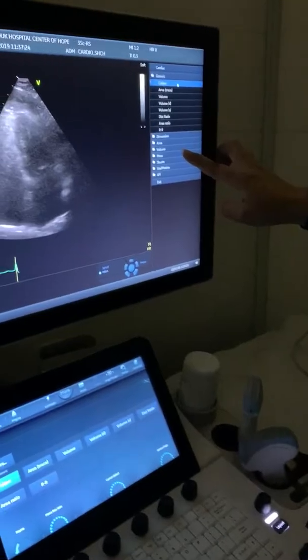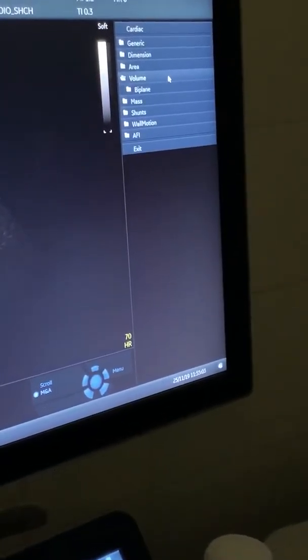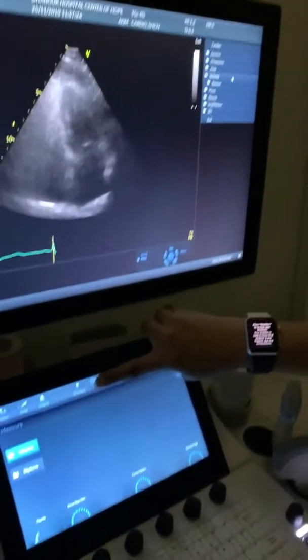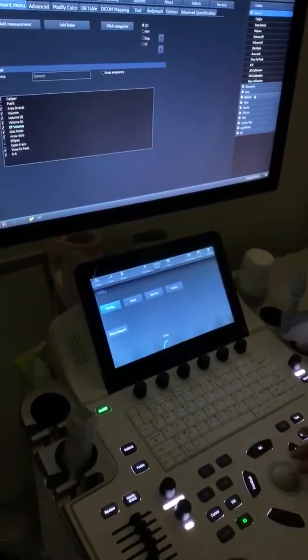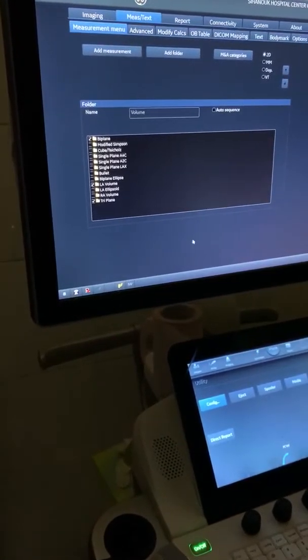If you want to go by volume, I hope there's left atrium. Oh, okay. I don't have it here. I need to go again to config. Let me see, doctor, if we have it here on the measurement. Here, LA volume. Okay. So we need to see now, doctor. It's LA volume now.